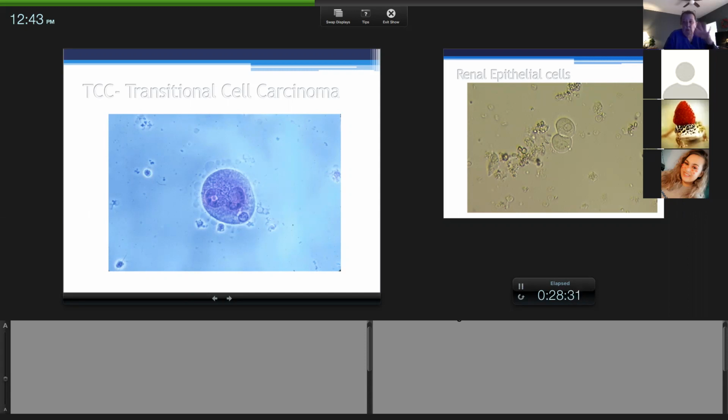Now, that is not your job to find on a urine, but that could be a question on the board exam: how do you know a cell is potentially cancerous? What are indicators of malignancy, which you should have gone over in Clin Lab 4? You look at your nucleoli, you look at your nucleus, you look for mitosis, which is dividing, you look for active, granular chromatin. Also extremely large cells. Remember, cells are typically large when they're immature and they start to shrink. So sometimes when you have a population of larger cells, which is called macrocytosis, those large cells can be an indicator of malignancy.